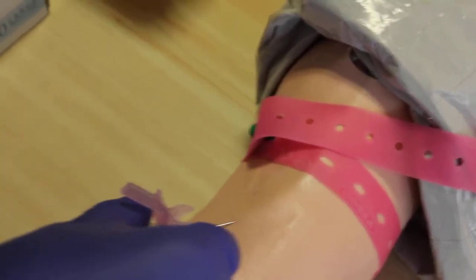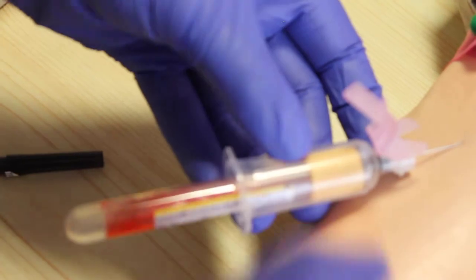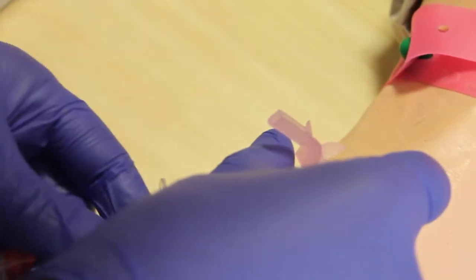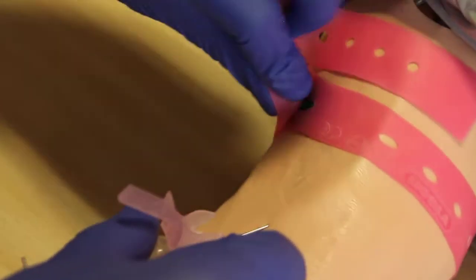Then you use the bottle, put it inside the vacutainer, and the blood comes right there, filling it up.